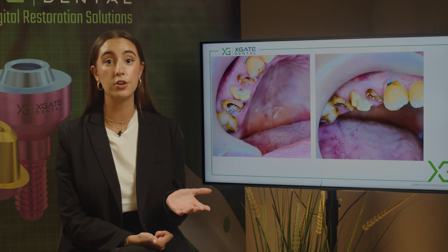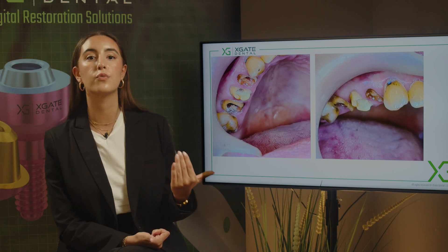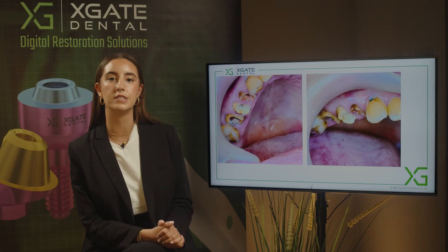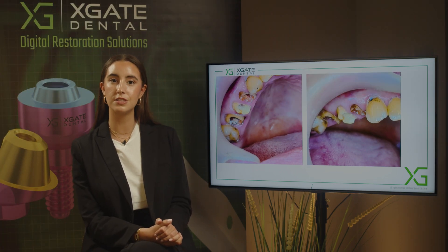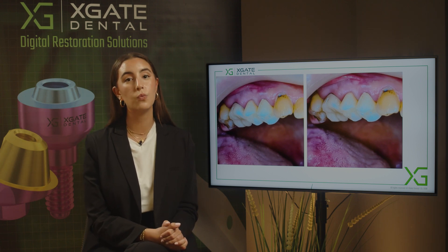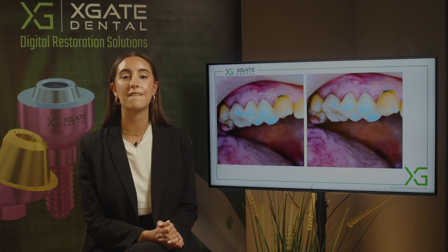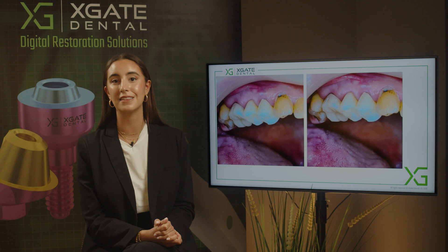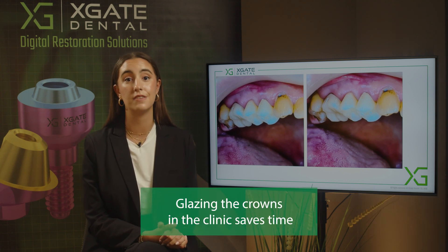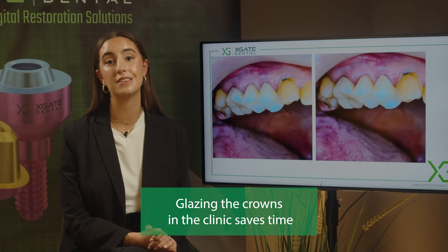It will probably hold better and you have less chance of breakage or vertical root fractures in the future. You can see that we tried the crowns on the teeth. We took the color from the patient's teeth and glazed the crowns ourselves in the clinic — to save time we're glazing the teeth in-house. In about 20 minutes you can achieve the same color without sending it anywhere. It saves time, and you can see there's no visible difference — you wouldn't know those three teeth are crowns.